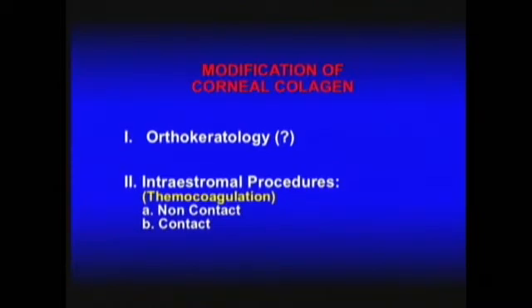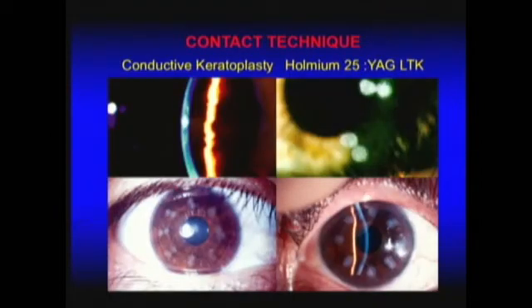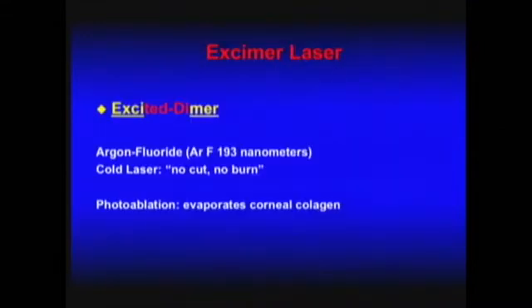So also we can use methods to modify the corneal tissue, the thermocoagulation, contact or non-contact with the Holmium YAG laser, but now they are not used at all.